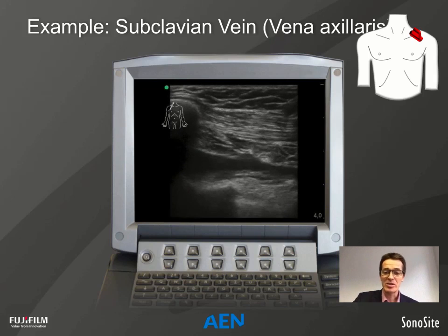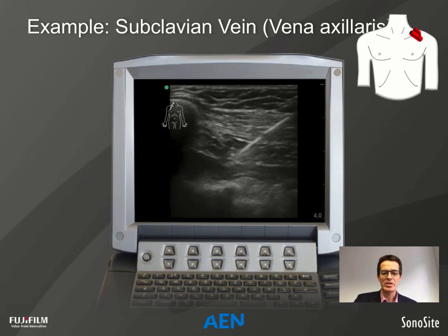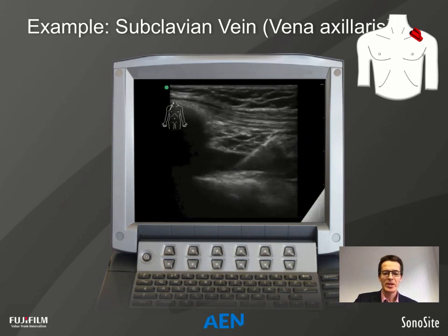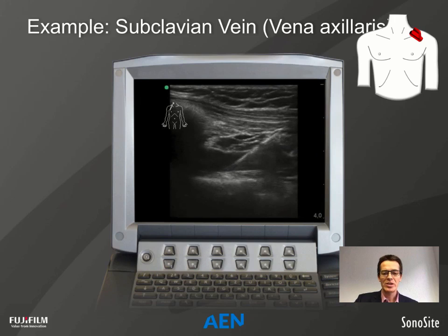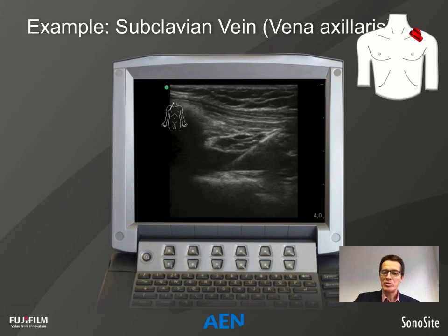We take an echogenic needle because of the steep angle, directing it toward the first rib as an additional safety feature against pneumothorax. Here you can see the guide wire placed directly into the vessel. Some experienced users pre-position the guide wire inside the needle, then place the needle tip inside the vessel under direct vision and insert the guide wire directly. This is quite smart, but only for experienced users.